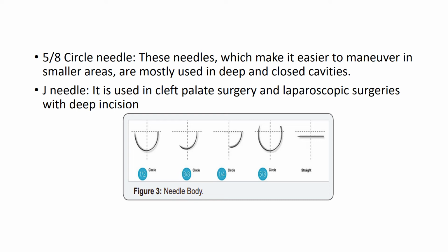So this is just to show the half circle needle, the 3/8 circle needle, the quarter circle needle, and also the 5/8 circle needle. And this is the straight needle.